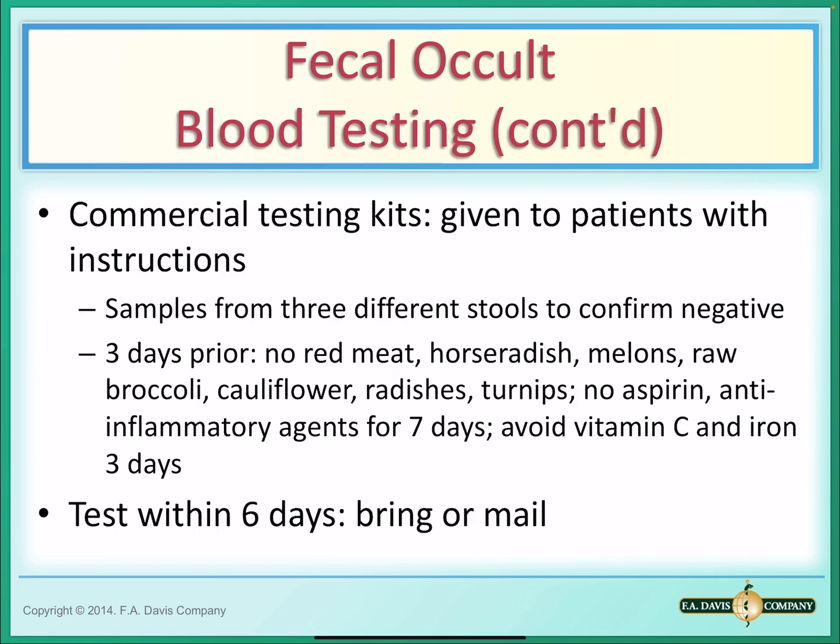Many commercial testing kits are available for occult blood testing with the guaiac reagent. The kits typically contain guaiac impregnated filter paper enclosed in a cardboard slide to which the fecal specimen and hydrogen peroxide are added. Two or three filter paper areas are provided for the application of material taken from different areas of the stool and for the positive and negative controls that must be included.